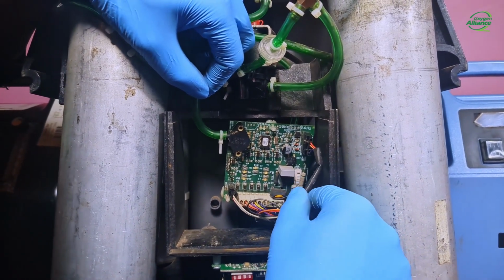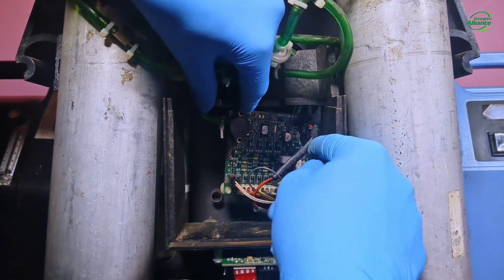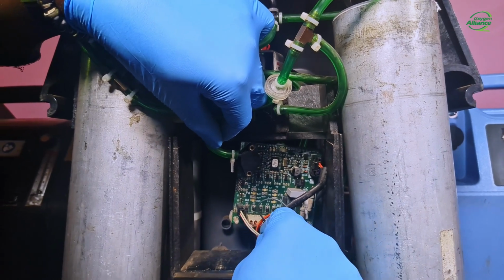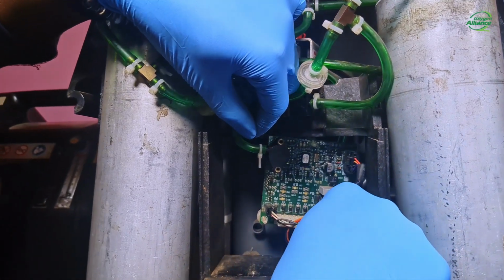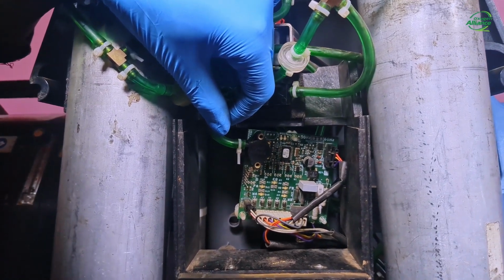This wire harness is for power supply. These 2 wires are for the fan. And then these other wires connect to the compressor and the control valve.